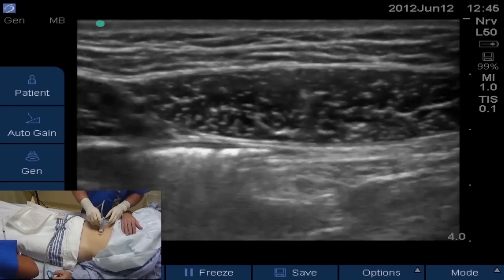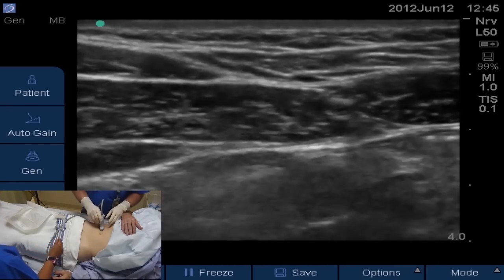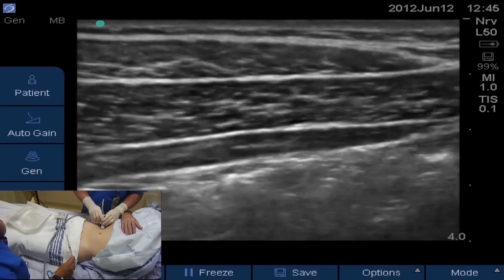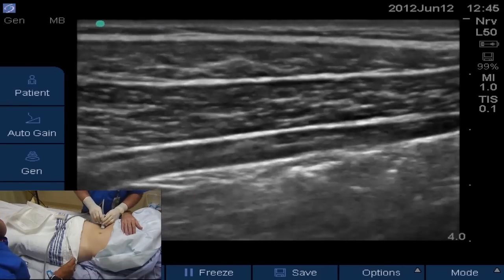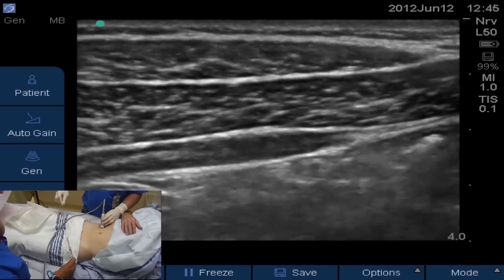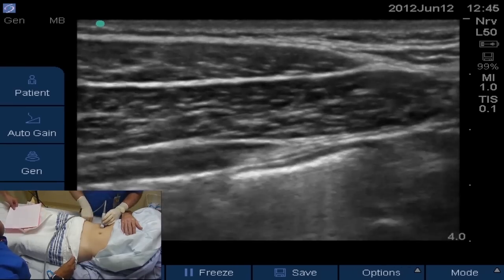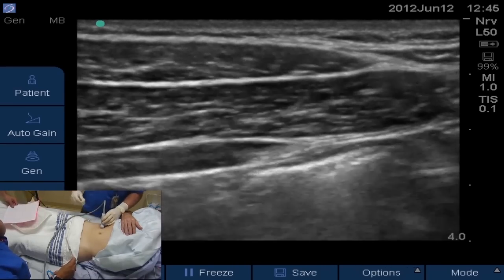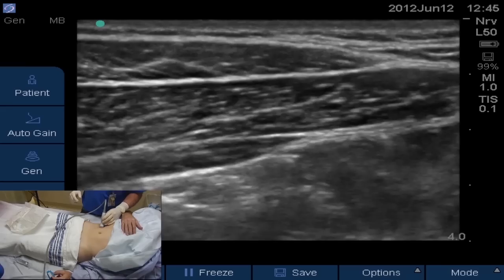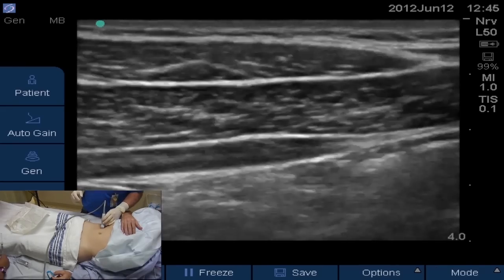You can see the rectus abdominis, and as we start sliding laterally, the internal oblique meeting the rectus abdominis, the external oblique more superficial than the internal oblique, and then deep to the internal oblique is the transversus abdominis muscle. The plane we want to get to is that plane between the internal oblique and the transversus abdominis — external oblique, internal oblique, transversus abdominis muscles.